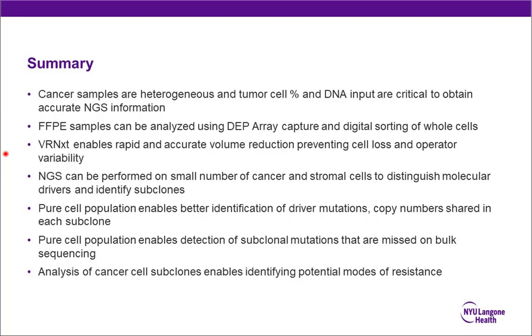Is this variability correlated with increased chance of metastasis or responsiveness to therapy? I would love to have an answer to that ready. The problem is that this was a biased cohort because we specifically were looking at people who progressed on immunotherapy with checkpoint inhibitors, and our cohort is relatively small.